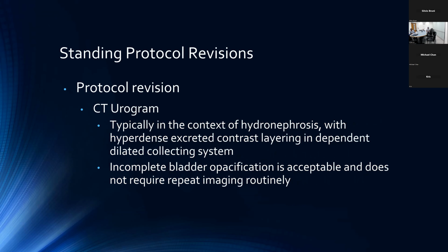So, what do I mean when I'm referring to the adequacy of the urographic phase? Generally we want good opacification of the upper renal collecting system on those urographic phase images. So that's the renal calyces, the renal pelvis, and the ureters, all the way down to the bladder.